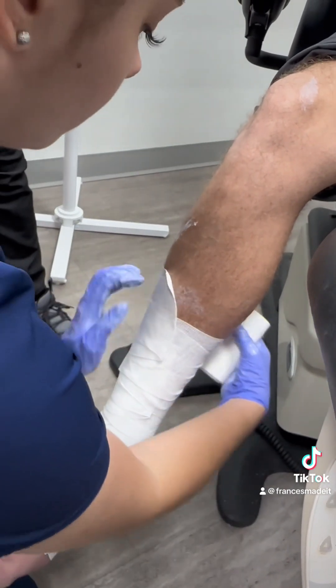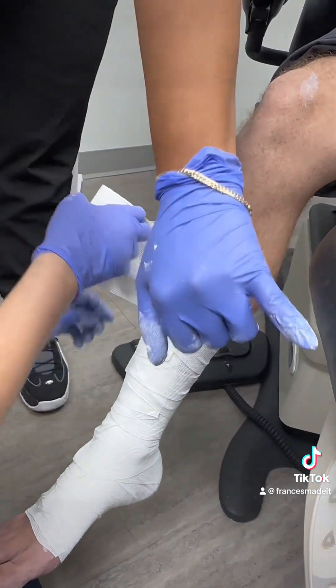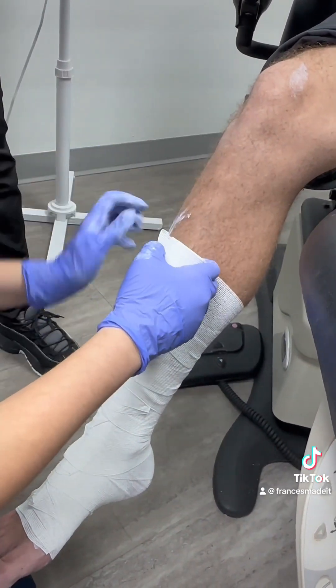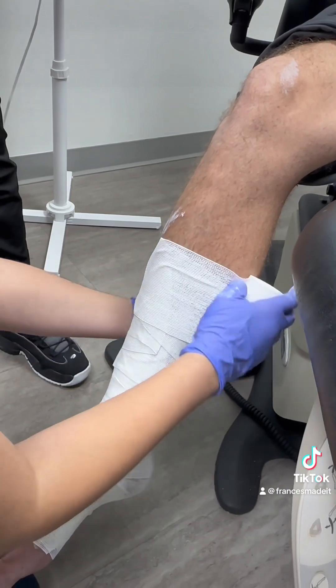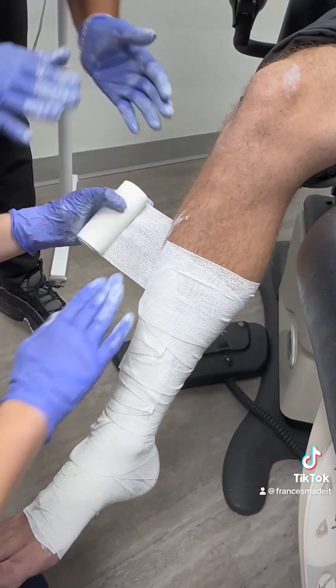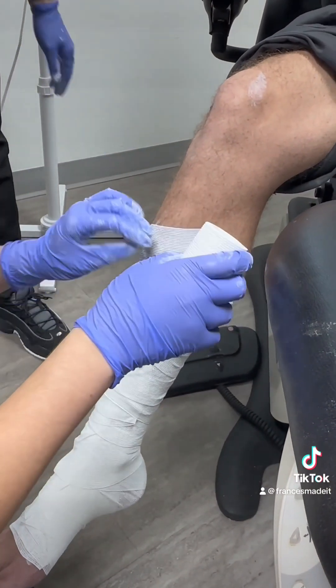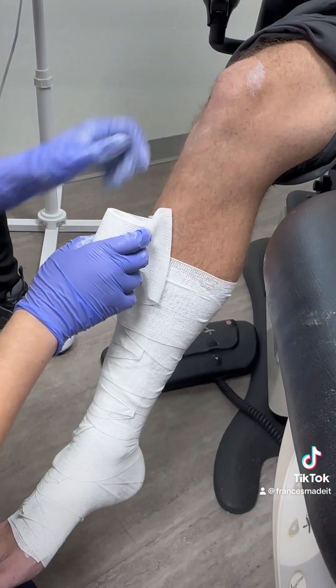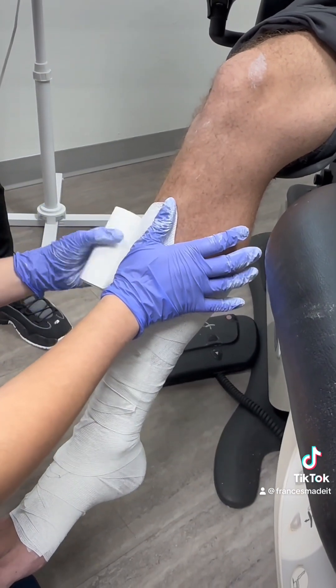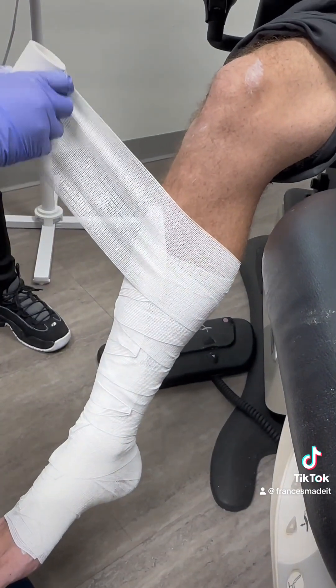It's a messy solution, so don't get it on your scrubs because it doesn't come out. Doing the folds allows that if they're swelling, it'll allow the compression to open up. Over time you'll get faster — speed comes with time.